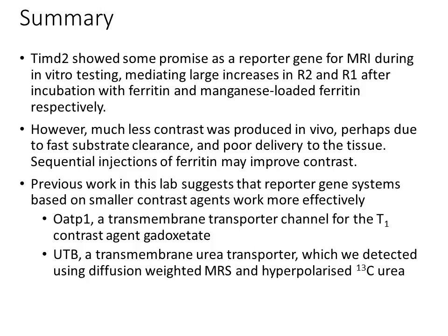Recent work from our lab has really concentrated on using small molecule contrast agents. For example, we showed with OATP, we're using a gadolinium chelate, gadoxetate, which gives positive contrast in T1 weighted images, and we also have shown that hyperpolarized C13 labeled urea can be used when we use the urea transporter as the gene reporter. And I think the advantage of these reporters is the contrast agent is much smaller and therefore should have better access to the tissue.